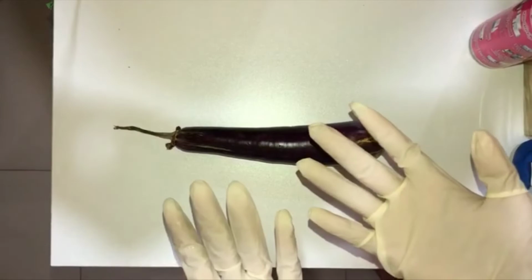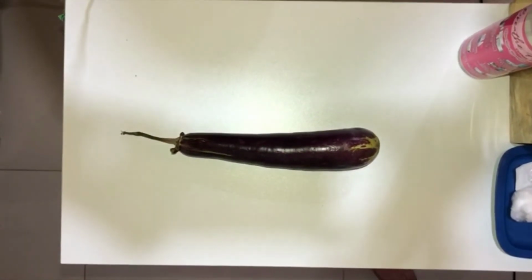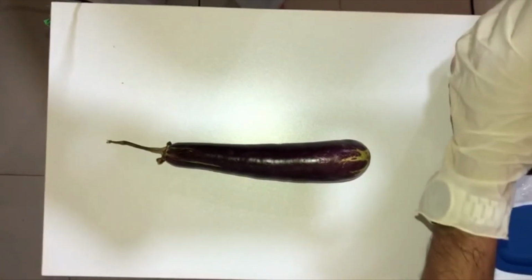Measure the fold from top to bottom and ensure that the needle is about half as long. Place the patient in a comfortable position. Ask the patient to relax the area you're about to inject. Apply clean gloves. Clean the site with an antiseptic swab in a circular motion, starting from the center outward.